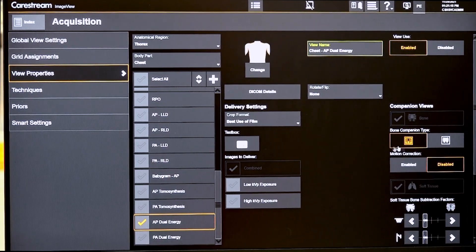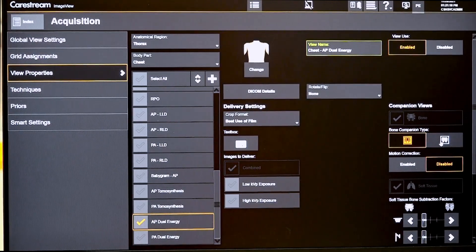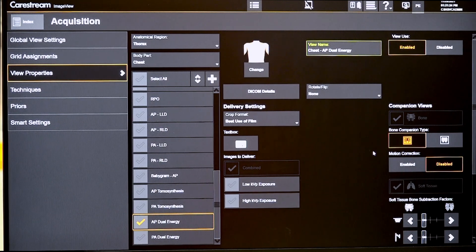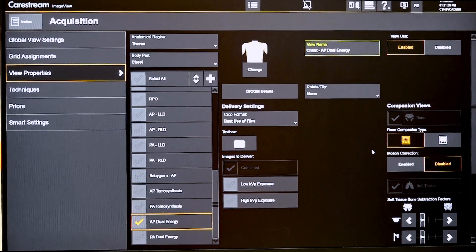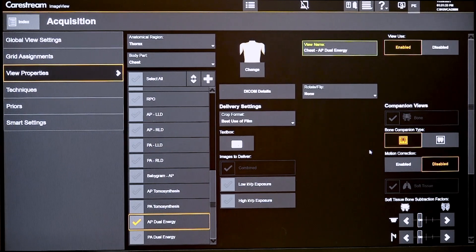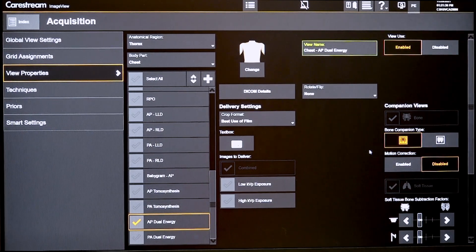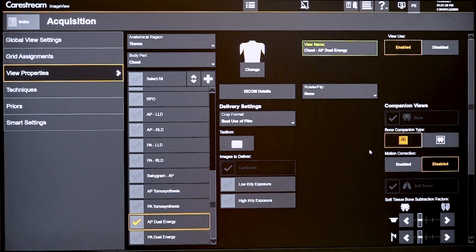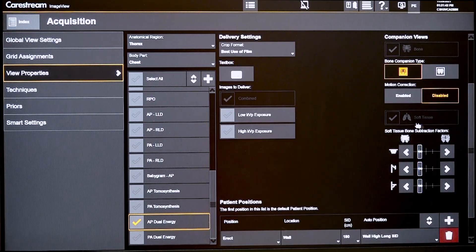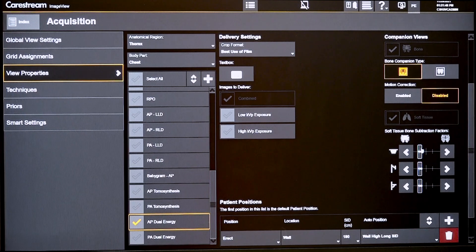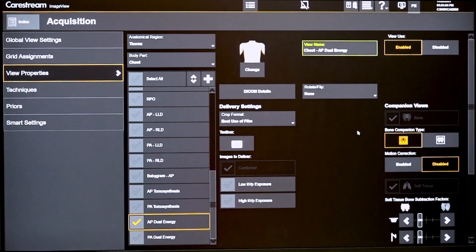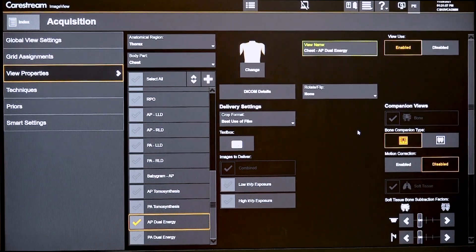They can also specify with the companion views whether the bone image is black bone or white bone, and whether motion correction is enabled or disabled. Motion correction is available because cardiac motion or slight patient motion can be corrected for, though the switching time between the two filters is rather small, so motion correction is usually not required. They can also adjust the bone transparency applied to the soft tissue image, but typically the default settings are used. That's an overview of dual energy from the image view console.